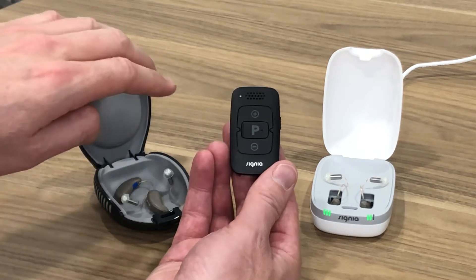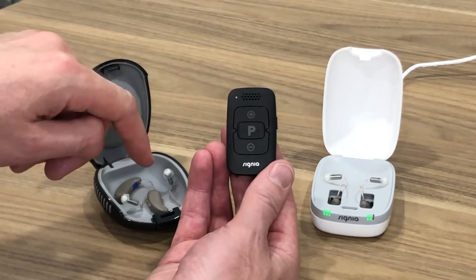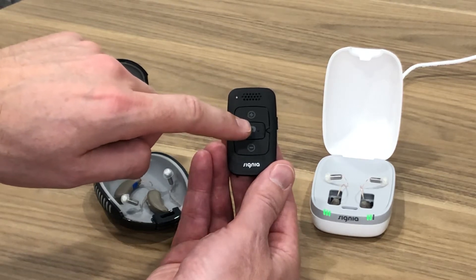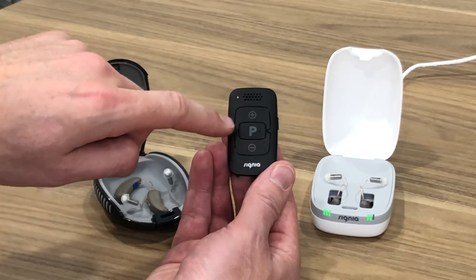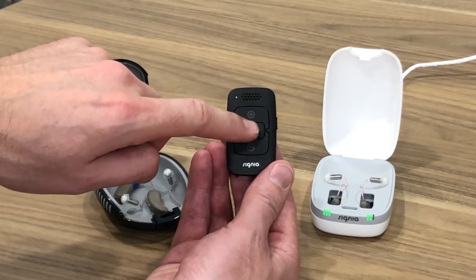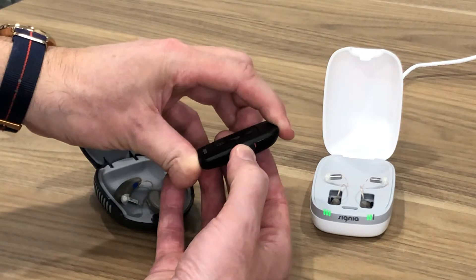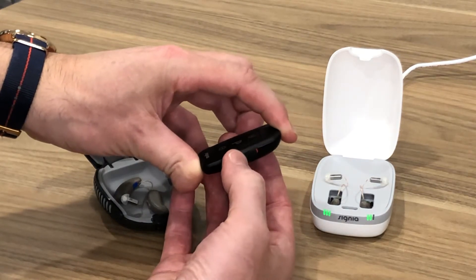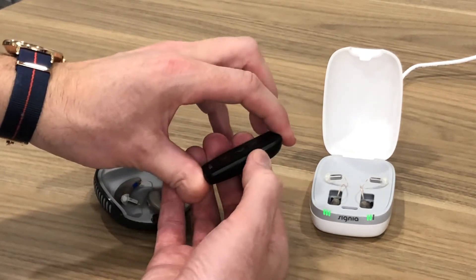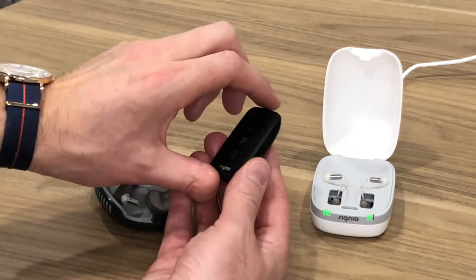Everybody would have a universal program on their hearing aids, but people might have a music program, a program for noisy environments to cut down on background noise, or maybe a program to pick up a TV streamer to bring the sound of the TV directly through the hearing aids. You can have numerous programs that you can access with that program button. On the side of the remote is an on/off or locking switch. When you push it up into the on position the buttons become active; when you lock it or turn it off, pressing buttons does nothing to the hearing aids.